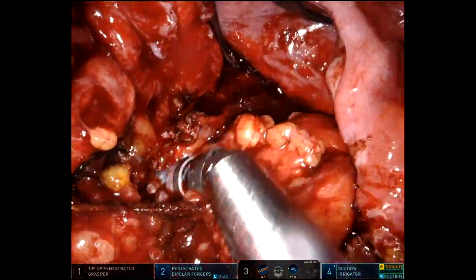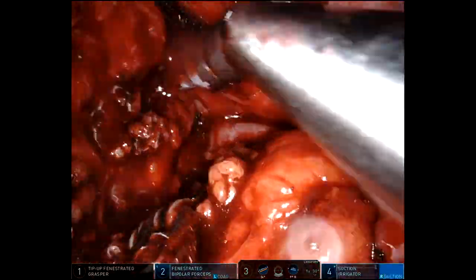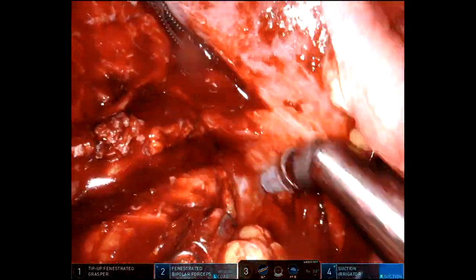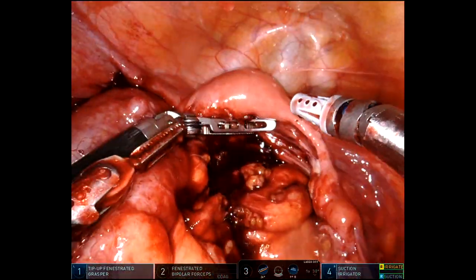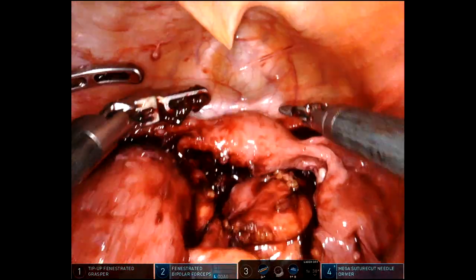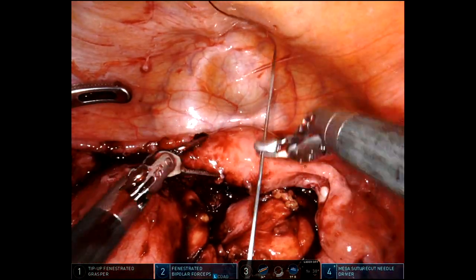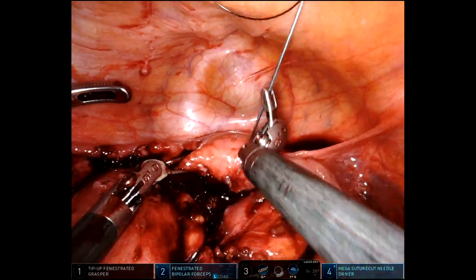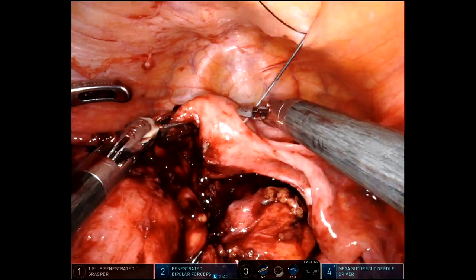These operations are not always very glamorous — you can see it becomes bloody at certain points. I don't think there's much you can do about that. Now that I've freed up the uterus a little bit, I'm going to go ahead and suspend it.